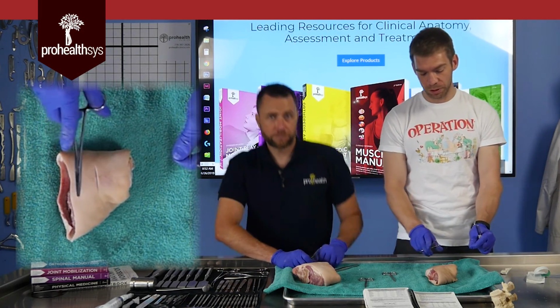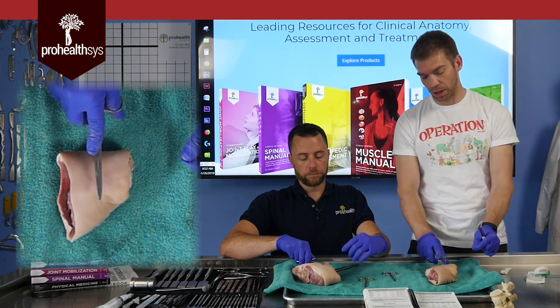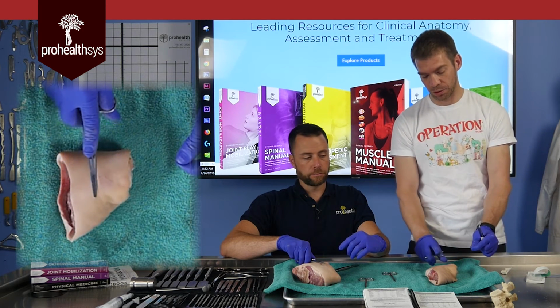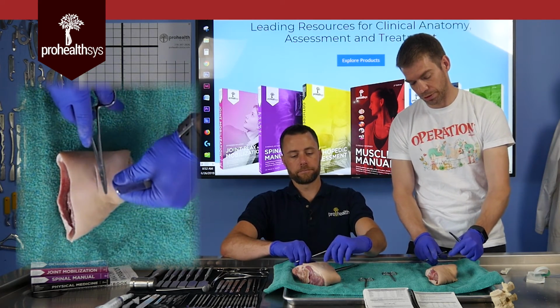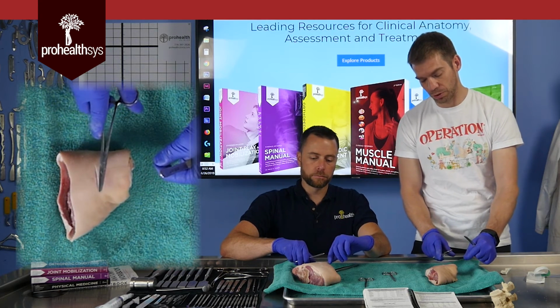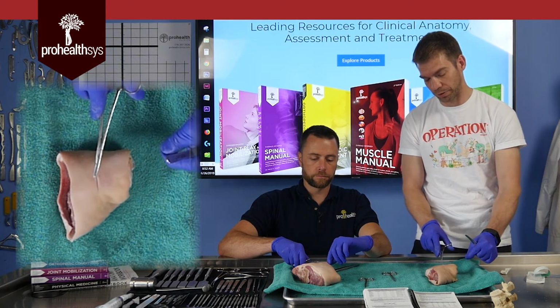Anyway, what I'm going to do is put my needle driver in the center of the wound, right over top of it. When you tie, you start out with your knotty instrument. The needle driver is also a knotty instrument, parallel to your wound. I'm going to loop it around once, then twice. Okay, give myself a little more space. You could even loop it around 3 times, but you don't usually have to. Note that the suture material goes right next to the hinge of the box of my needle driver.